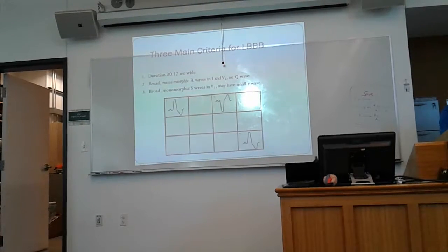Now, this is an interesting one. Look at number 12. First of all, it's supraventricular.